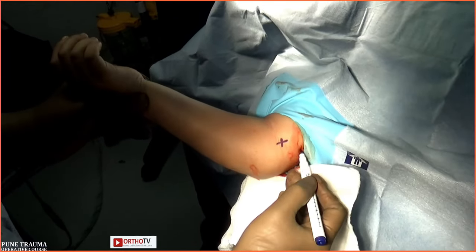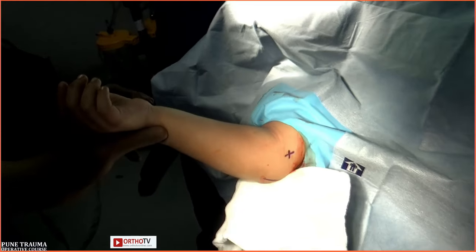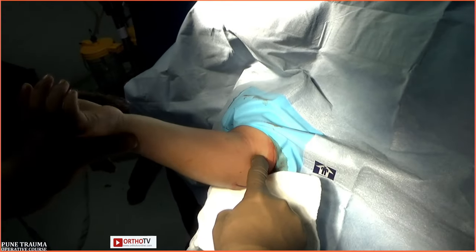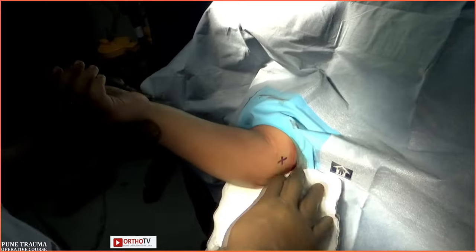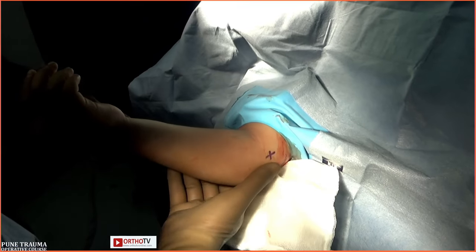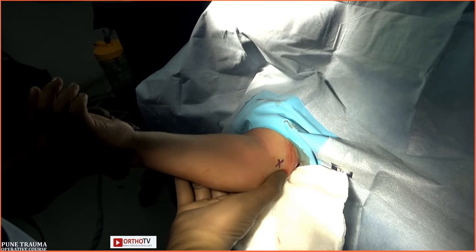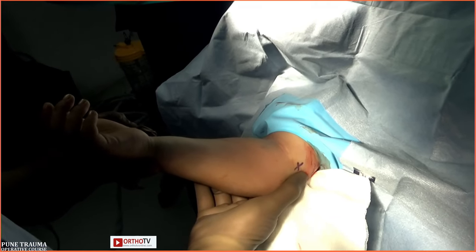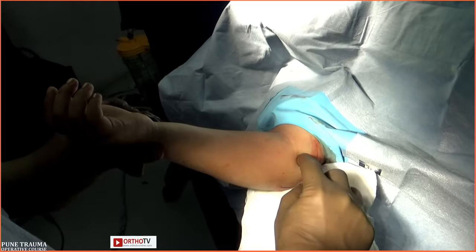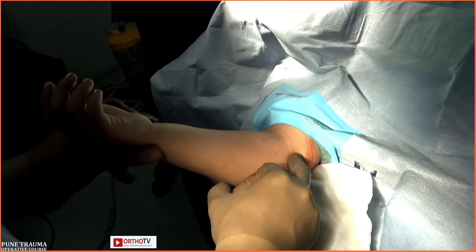Yeah, this is the ulnar nerve course. So you want to go anterior so that you avoid the ulnar nerve. Yes. And you want to keep the elbow in extension so that you prevent subluxation of the ulnar nerve. And when I pass the pin, I put my assistant's hand or thumb here so that at worst I will impale his thumb and not the ulnar nerve. And from here we go anteromedial to posterolateral from the epicondylar region.